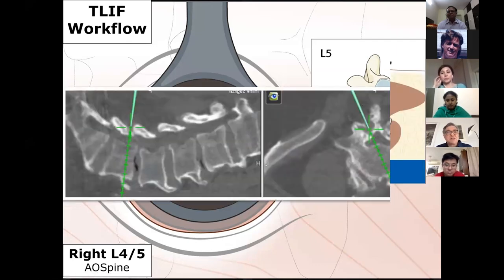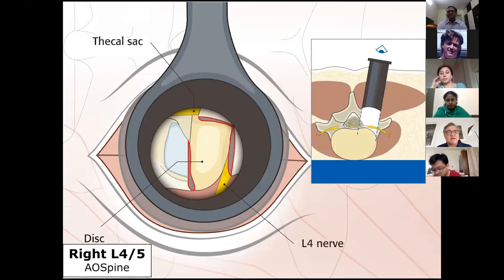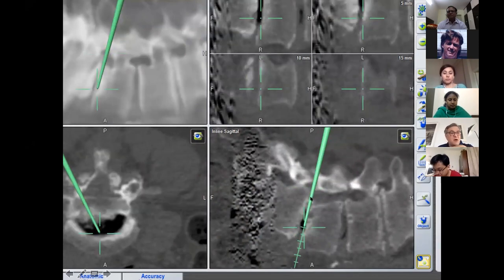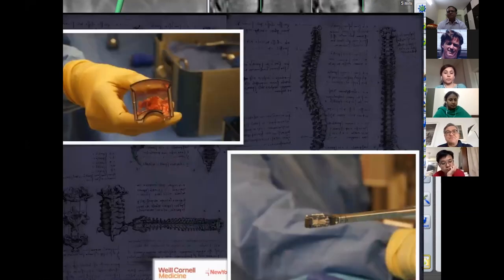In this case, we use navigation to find the pedicle. Then you see space, you see the traversing nerve root here, the exiting nerve root there. And then you start working on your discectomy. And here also navigation can become handy, especially in patients who have a very collapsed disc space, or where it is hard to really get into the disc space. You can use navigation to find a step-off in patients where there is significant spondylolisthesis. And then you can confirm that you actually got into the disc space and are in the right position.